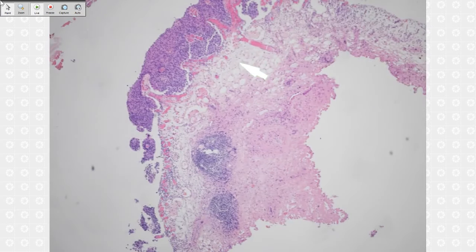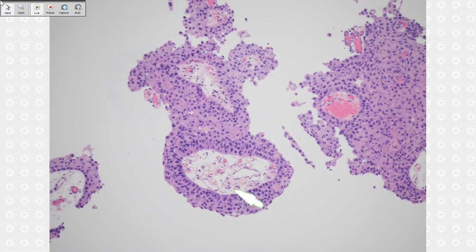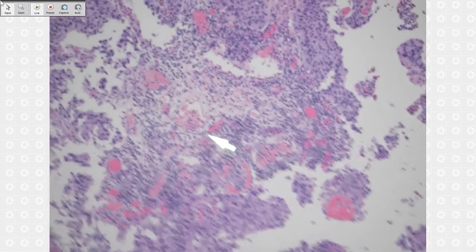So this urothelial carcinoma, right? High grade, right? For lamina propria invasion, you have to find the lamina propria, right? So what about that? You can treat this lamina propria too. Okay. So yeah, lamina propria right there, like you passed it already. Right on the top. Yeah, here, right there.